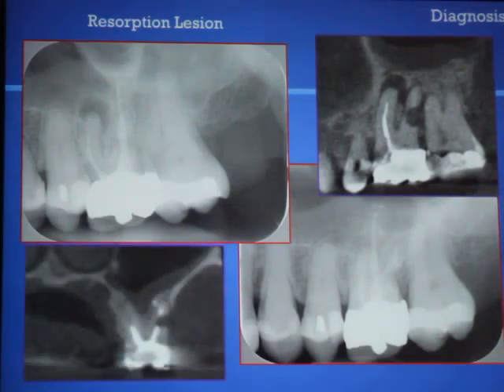This is a very effective way of diagnosing the problem non-invasively, and it really saves a bad experience with the patient, where you started the root canal retreatment and then you realize there's a big lesion there and the tooth cannot be saved.